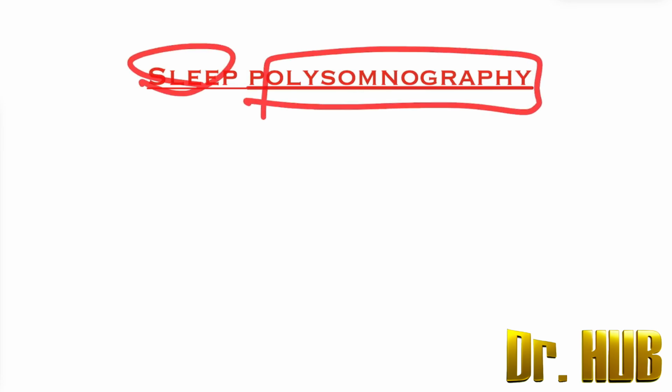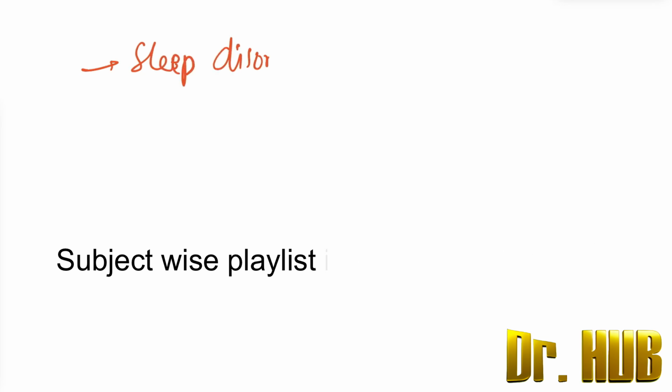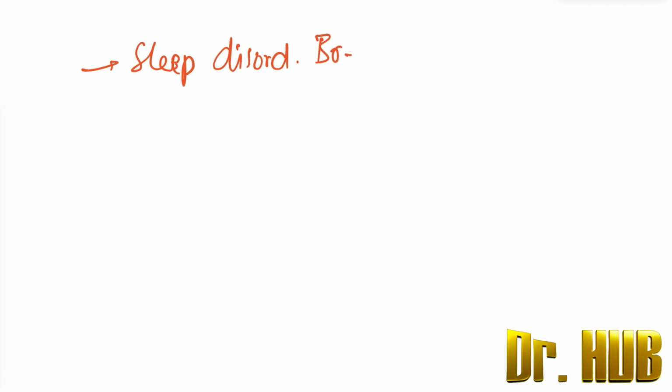Sleep polysomnography. The sleep polysomnography is a test tool for evaluating sleep disordered breathing. So what is it associated with? Sleep disordered breathing. And such disorders, what does it include?